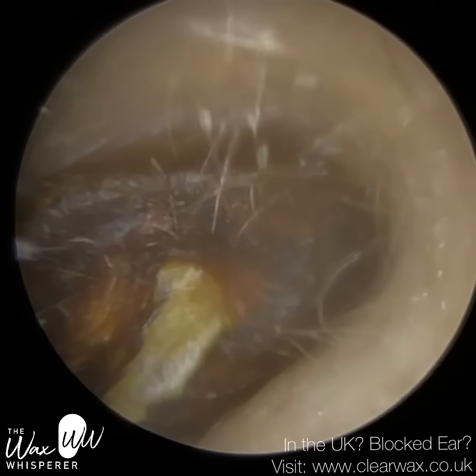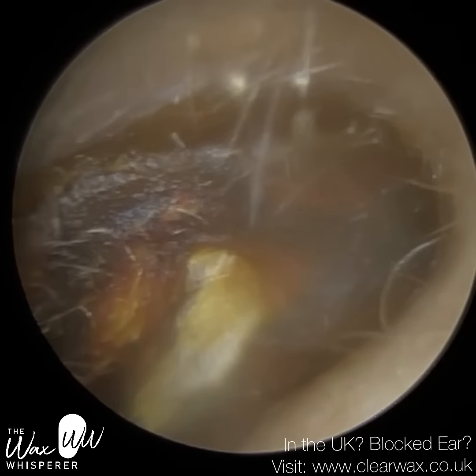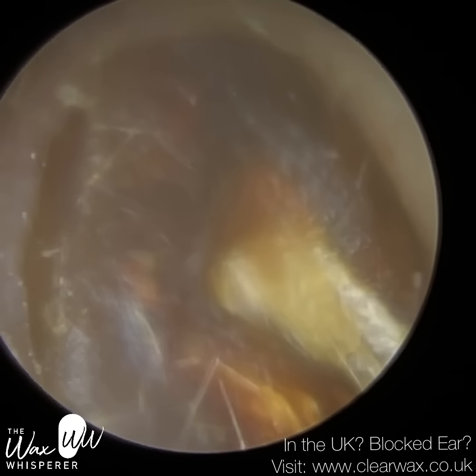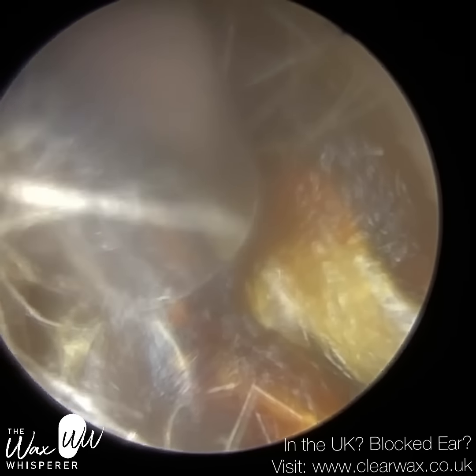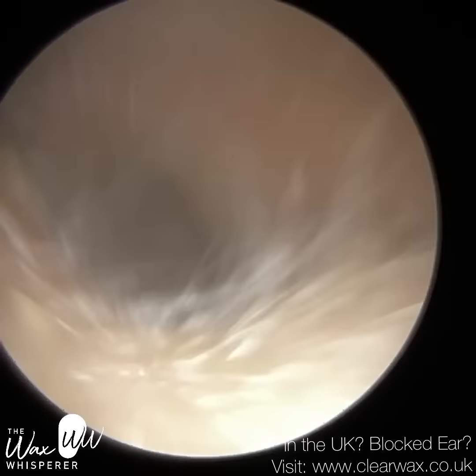So this is patient number two. Patient number two, similarly to patient number one, attended with a very dry, firm, embedded and adhered wax keratin plug, probably about a third or half the way into the canal. I initially introduced the Zollner suction probe, but as you can see, the wax plug is just too dry. I'm not going to get a suction grip here.